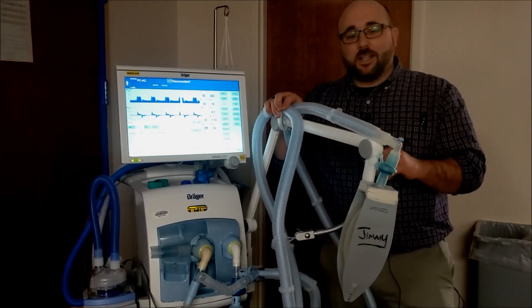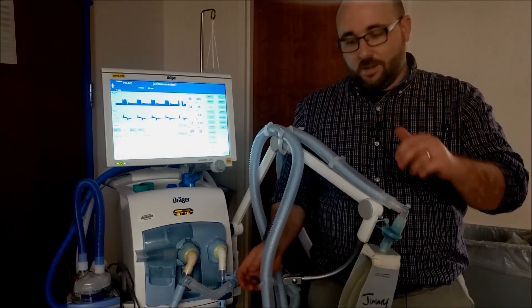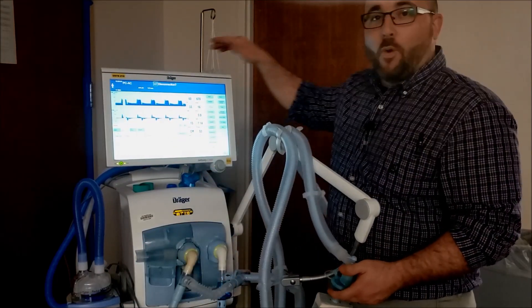What's up today guys? Welcome back to the RT Clinic. Today we are doing the internet sensation: two patients, one vent.